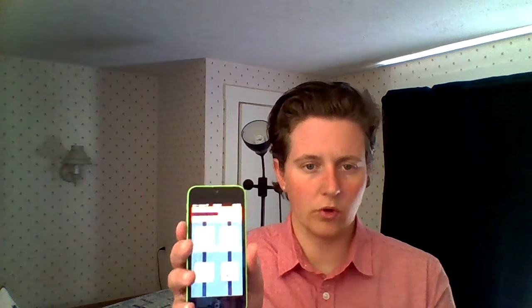So I'm going to move in and hopefully you'll be able to see this a little bit. As of right now, what I would do as the teacher is point to something, and this would be more of an iPad, so it's a little larger so the student could see. So for example, here I'm going to hit I want, and if you listen carefully, you should be able to hear it. I want. And at that point, that prompts the student to move to something.